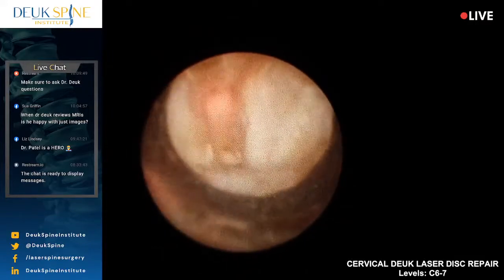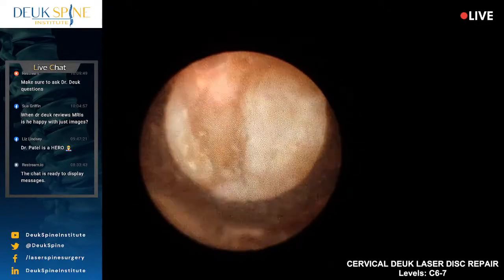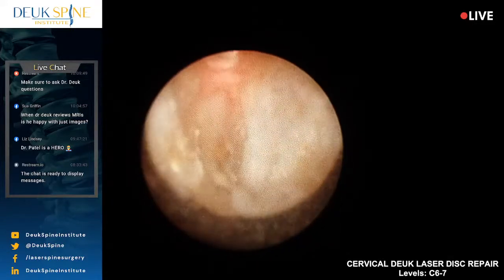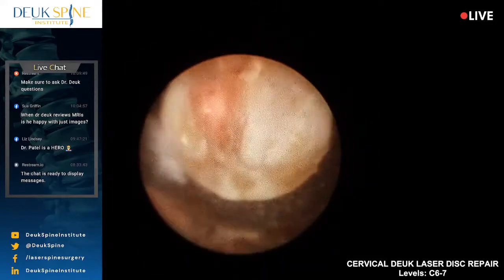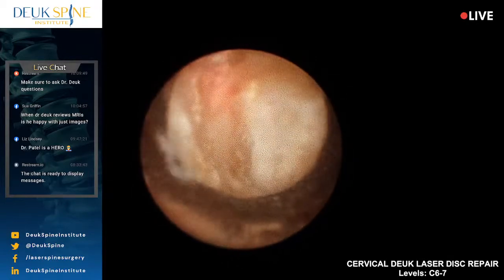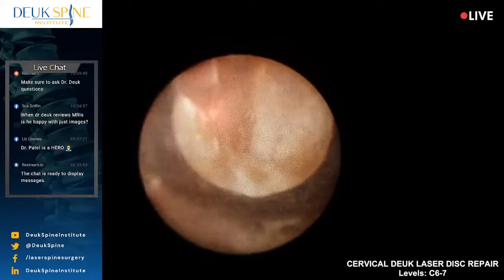And the reason you can see a reverse herniation is because we're inside the disc with the scope. You're actually looking at the back of the disc right now, where the nerves and spinal cord are, right through that little gap. So that's where the reverse herniation came from. It was actually sitting on the nerve and the spinal cord. Okay? So I'm going to keep working this for the next 15 minutes or so. And these are bone spurs here that I'm removing with the laser.